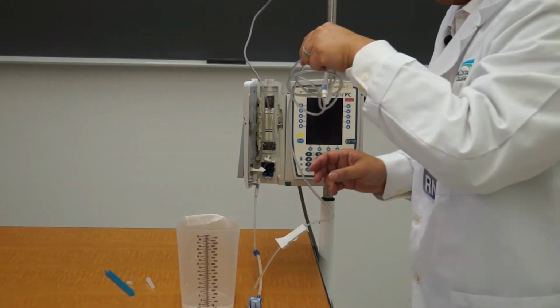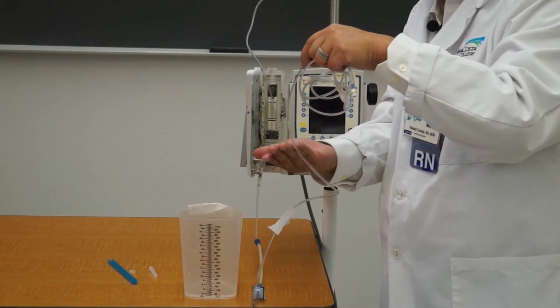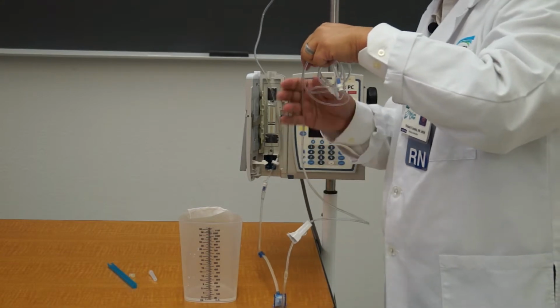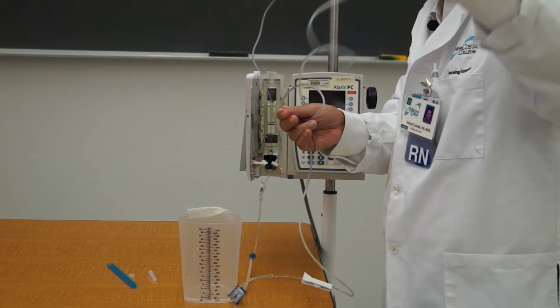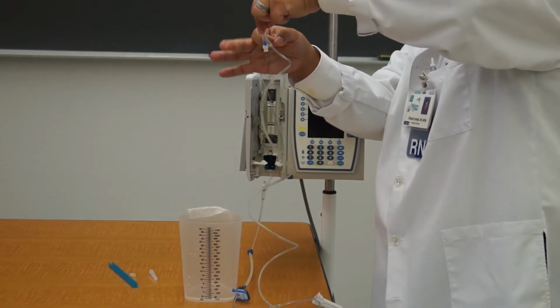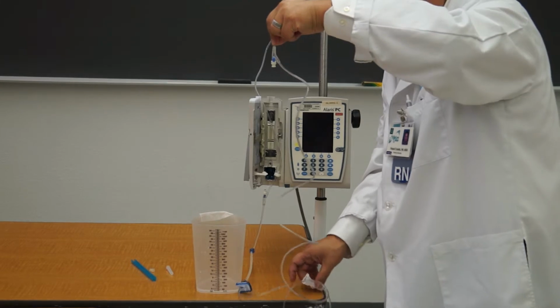You'll find that if people rush, they actually create more bubbles. So look how slow it's going right here. And I'm just going to stand here and make sure that I get to the next Y site, this one right here at the end, so I can flick the bubble out, okay? See, it's not even there yet. So I'm waiting. It's right here.